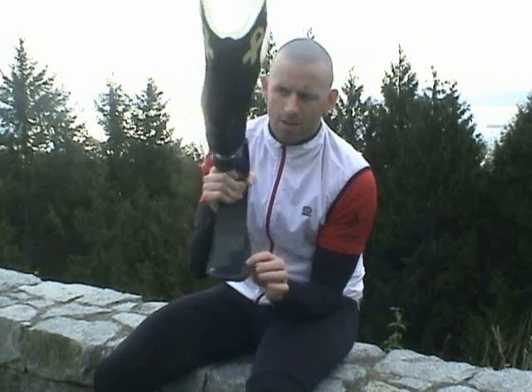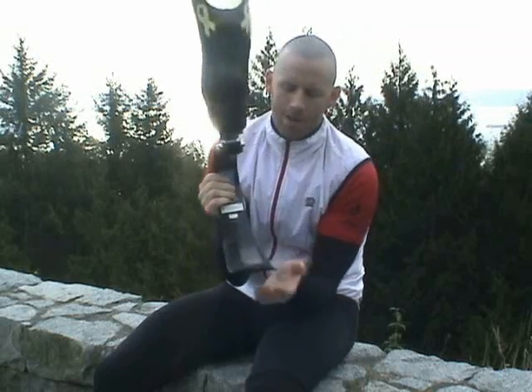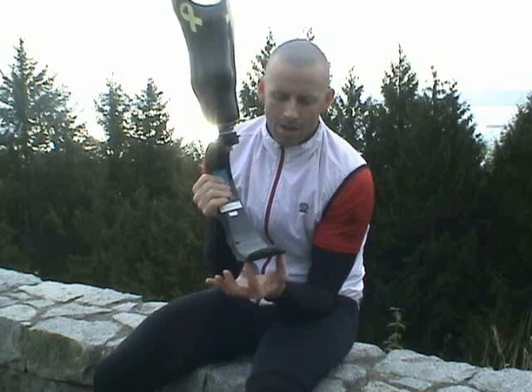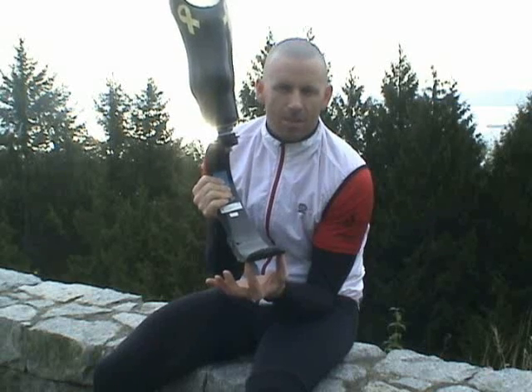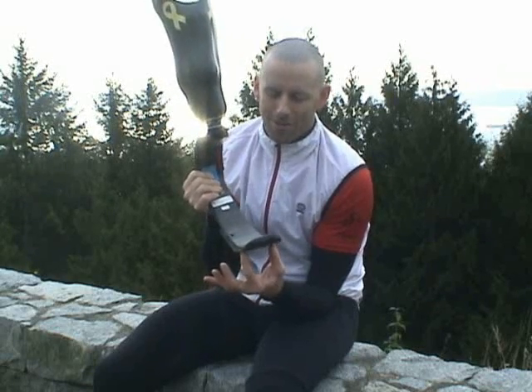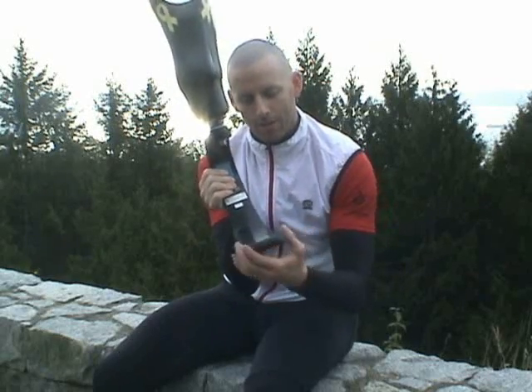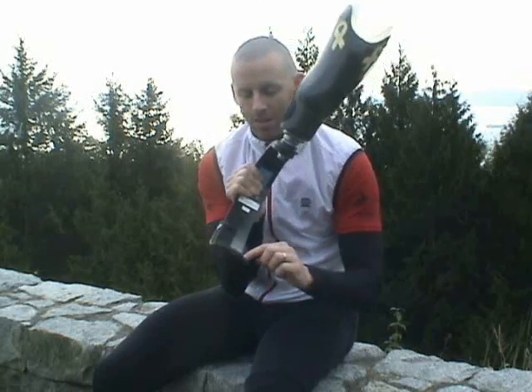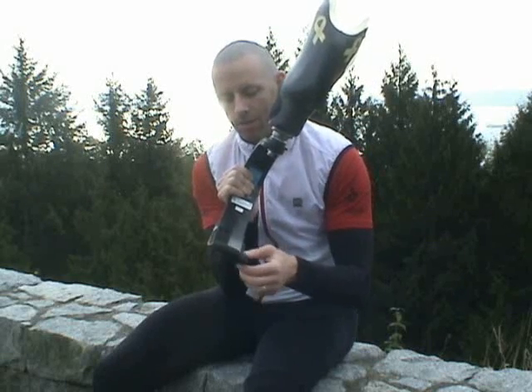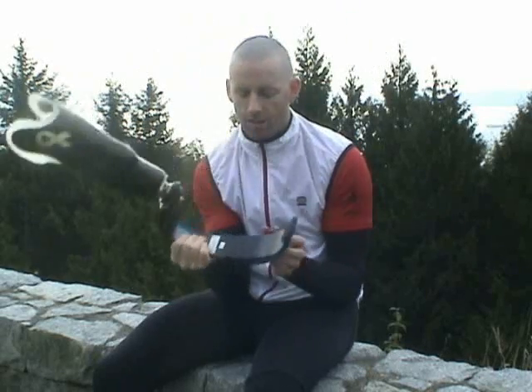He makes it a little bit wider so that when I run around a corner, it will flex and hold me, because you have such a small amount of surface area on the ground when you run. If it's slippery or wet or snowy, you have to be very careful. By making the sole wider, when you go around a corner, instead of having 1 millimeter of carbon fiber on the ground, it flexes and allows you to keep more surface area on the ground, which is very good.